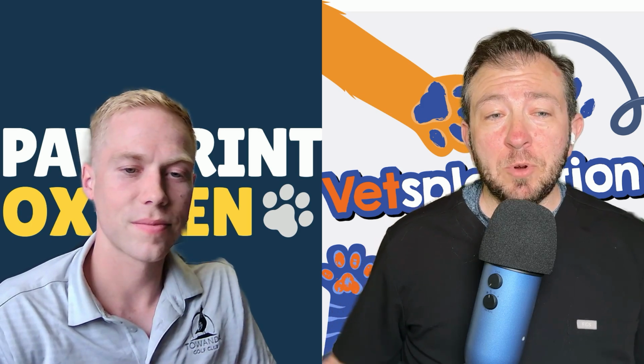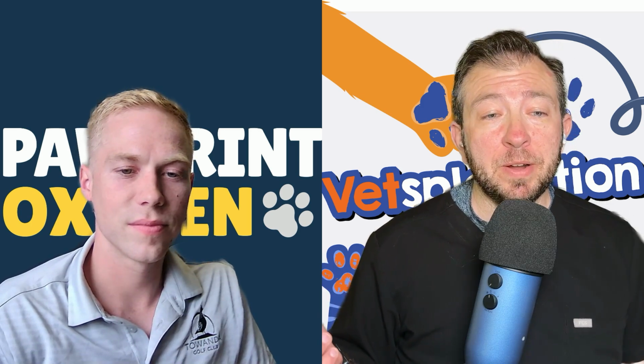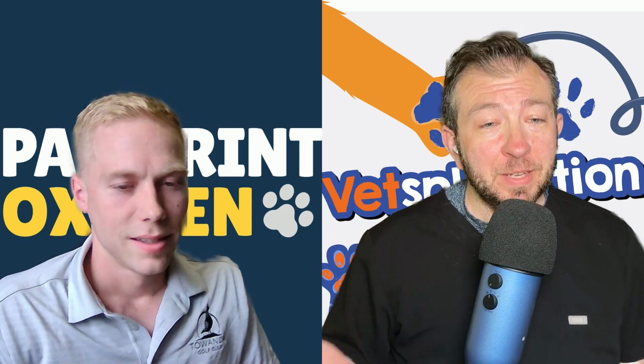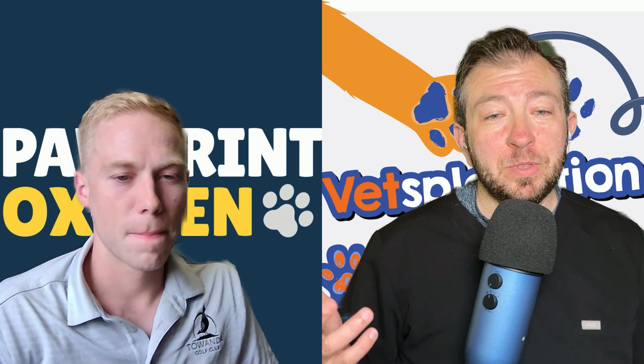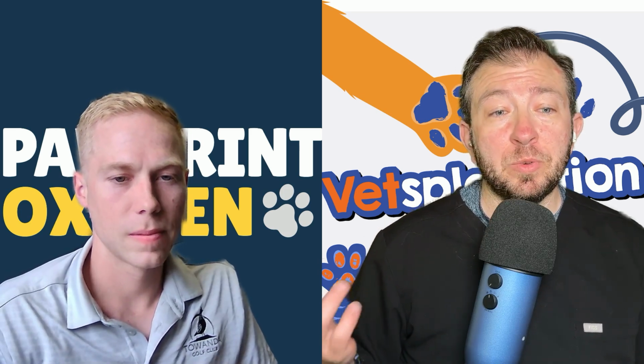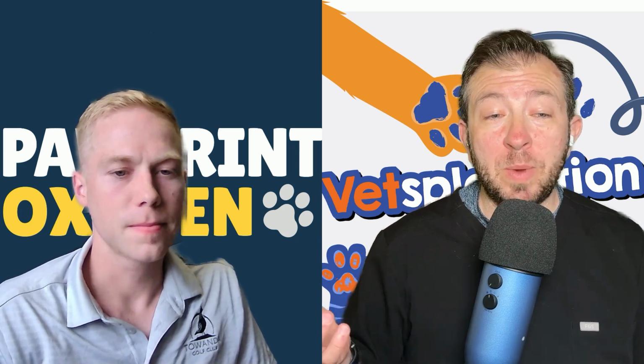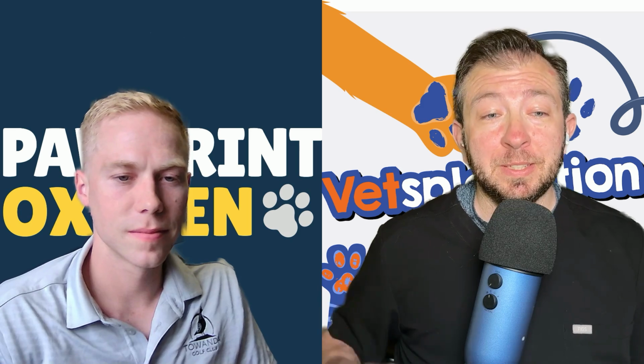And I also send them home with it, or I talk to people about it when they have dogs who have really flat faces, brachycephalic syndrome. I talk to them constantly about that. I'm like, your dog is going to have a problem during the summer, and you really need to make sure that you have something you can quickly give them. And so this is a great way to just have something available.